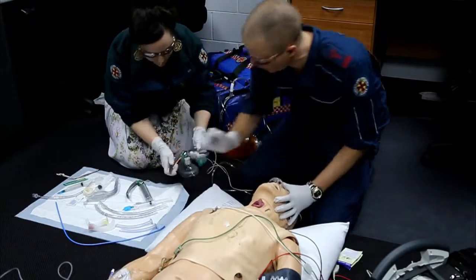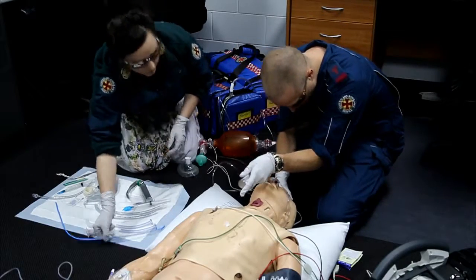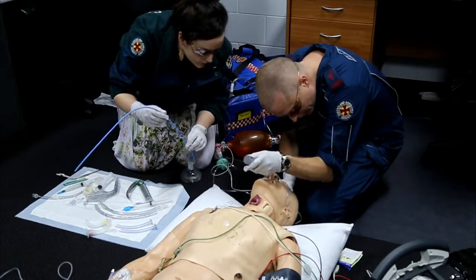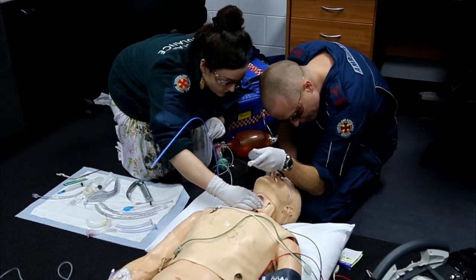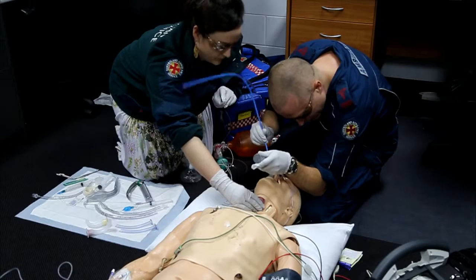Okay, scope. You got Grade 3 view. I might get you to provide some laryngeal manipulation. That really improves things. Okay, bougie.